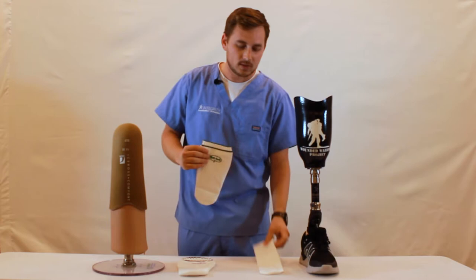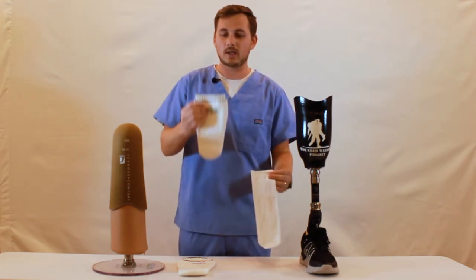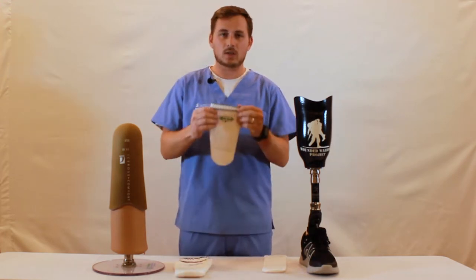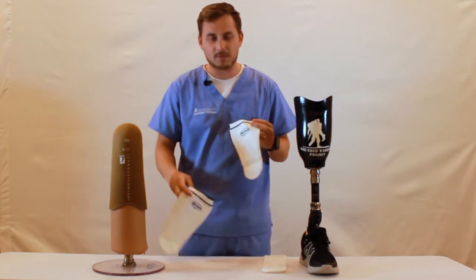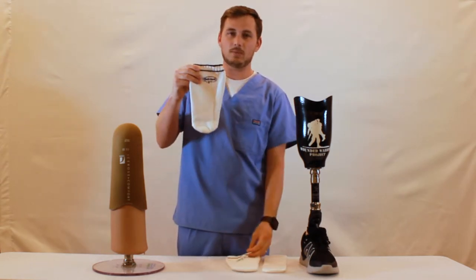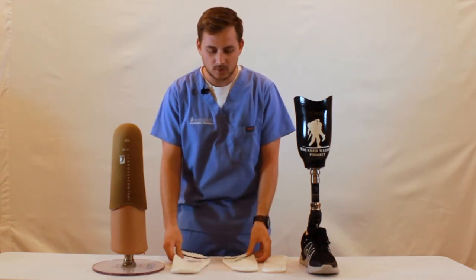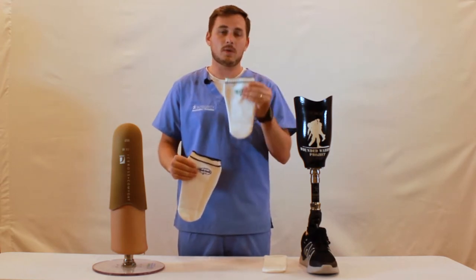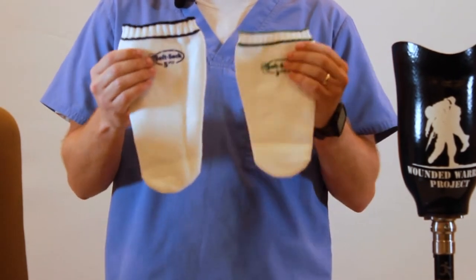Socks can come in various plies, and ply is the way we measure the thickness of the socks. They can come in one ply, three ply, or five ply. Sometimes they are color-coded — this specific manufacturer uses green to identify a three ply and blue stitching to identify a five ply. It's very common for patients to use a combination of socks, such as a three ply and a five ply, which equates to an eight ply.